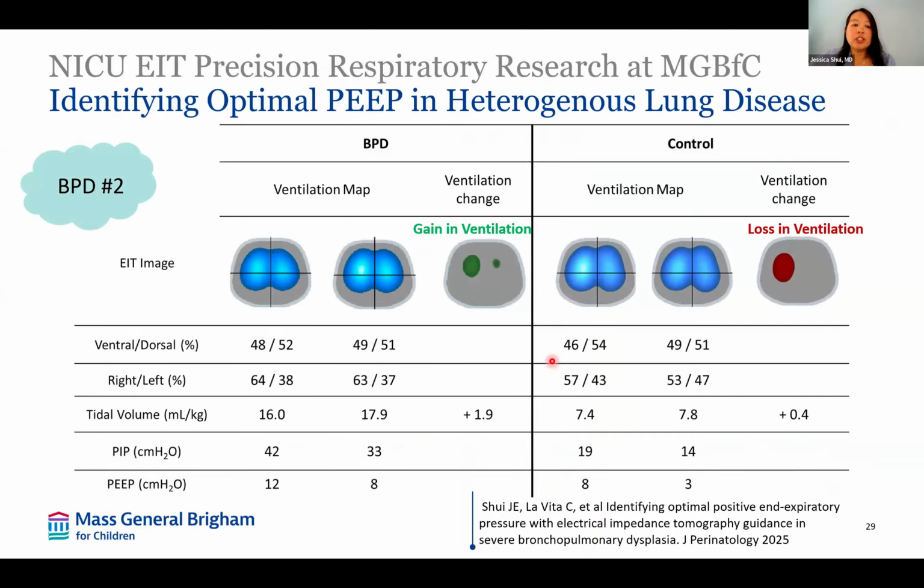Here's another patient who similarly was overdistended on X-ray, was very labile, was on inhaled nitric oxide, muscle relaxation, sedated, like the whole book was thrown at him, and he was escalated for an acute hypoxic event. His PEEP settings went up to 12 from his baseline of 10, and he was very labile. His FiO2 was like 90, 100%.